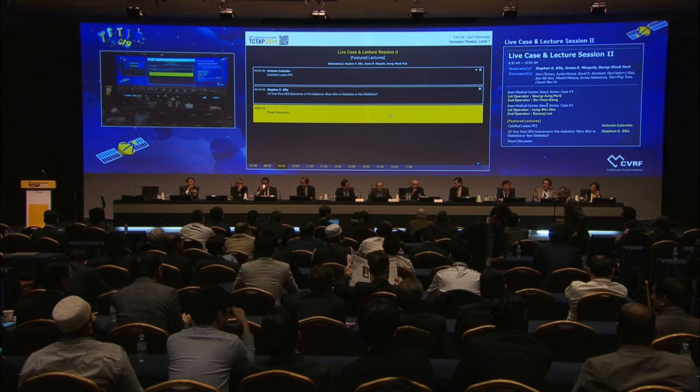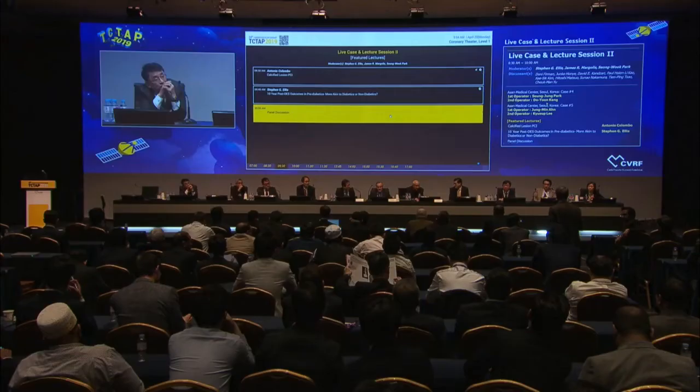Dr. Colombo? In the kind of lesions we're talking about, if your initial balloon doesn't fill out completely, you need to either debulk or use a high pressure balloon, or more likely both. And after debulking, for instance, with rotablator, you need to take a balloon that's perhaps a half a millimeter less than what you want to use for a stent, blow it up to whatever pressure is necessary. If that balloon will then fill out, then you have a perfect situation for stenting. If that balloon still has an imprint on it, then you should do some more debulking.